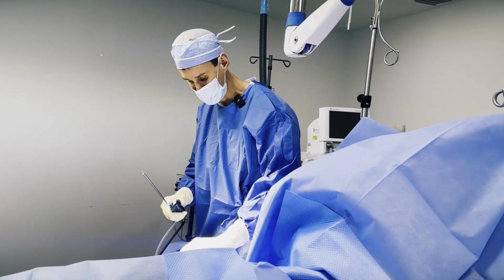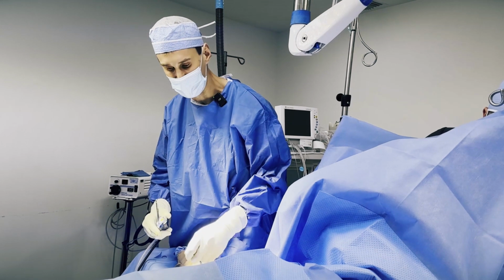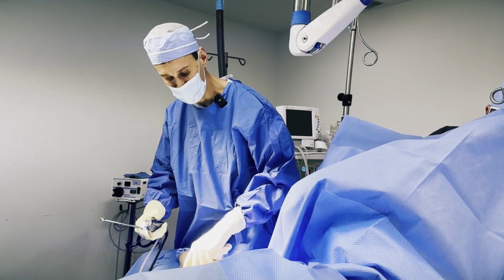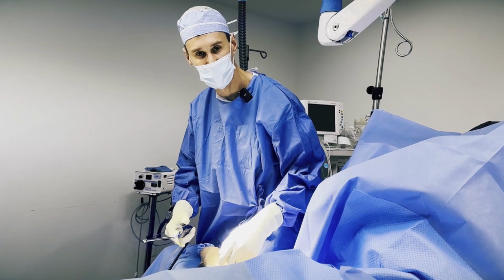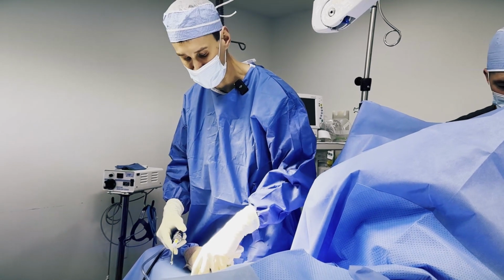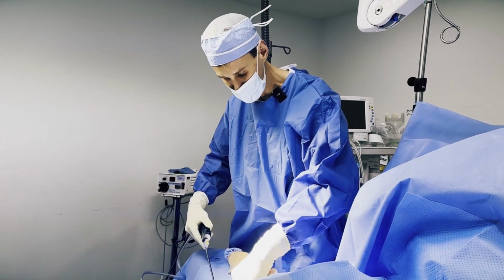So the next step of the procedure is fat removal. We infiltrated the numbing medicine and let it sit in there. The next step is to use this power tool. Basically, it's a hollow metal tube that suctions the fat out of the arm. We're going to do that before we do any skin excision, because again, it's rarely just fat or just skin. It's usually both. So we're going to remove all the fat using power-assisted liposuction.